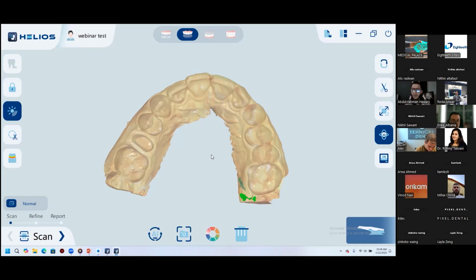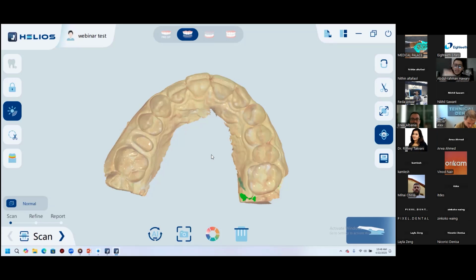But in order to change the standard numbers, we have to totally eliminate the possibility of reaching this maximum amount of deviation. So they are the same numbers, but with better user experience and less probability of reaching the worst case scenario.